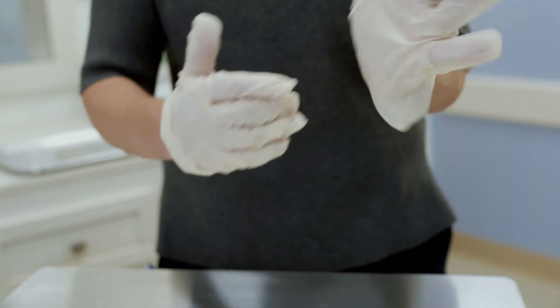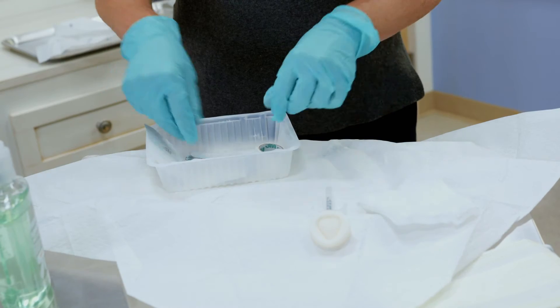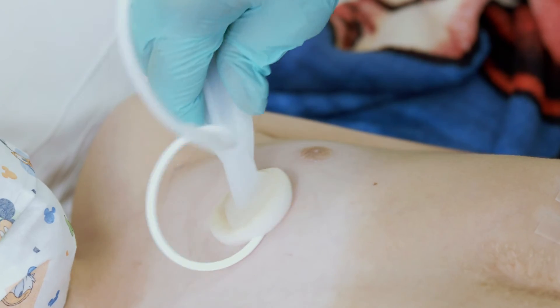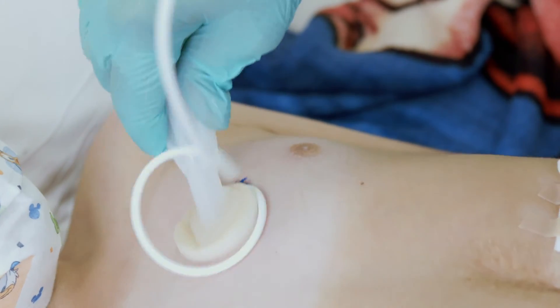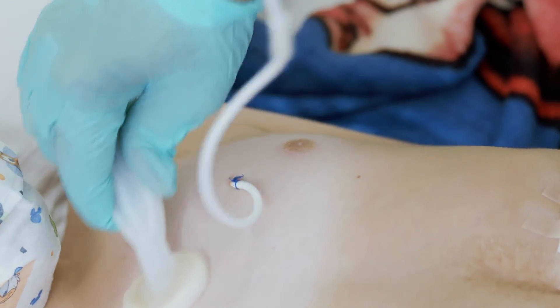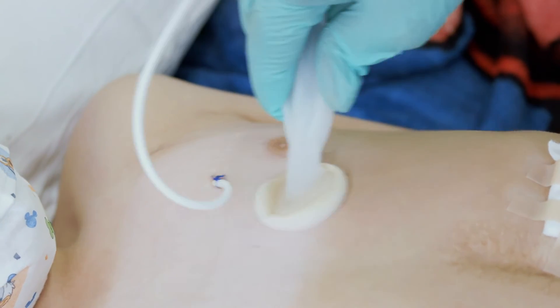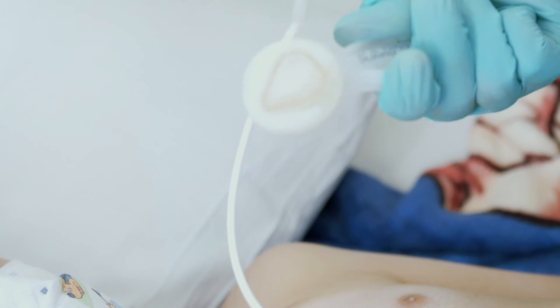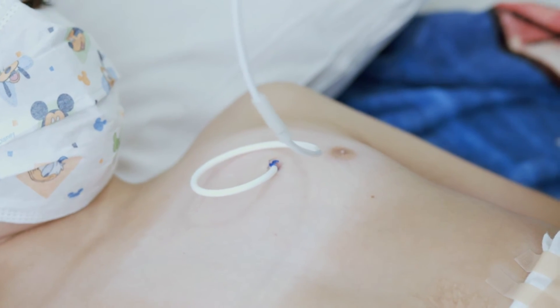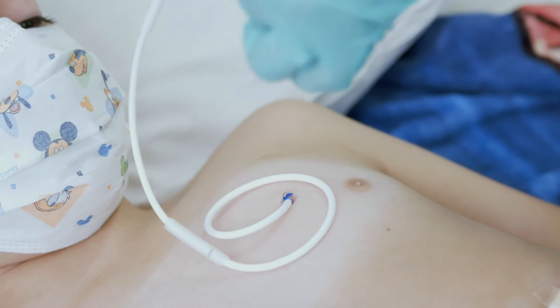Your kit may come with chloroprep swab sticks or a sponge wand to clean the skin. If your child has a sponge wand, pinch the wings of the sponge until it gets wet. If your kit has swab sticks, clean the skin with each swab stick for 10 seconds. If your kit has a chloroprep sponge, scrub a two-inch area around the skin site, including the catheter, for 30 seconds using a back-and-forth motion. Let the skin air dry completely — do not fan the area dry with your hand.